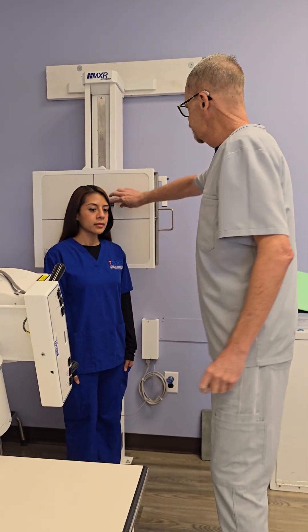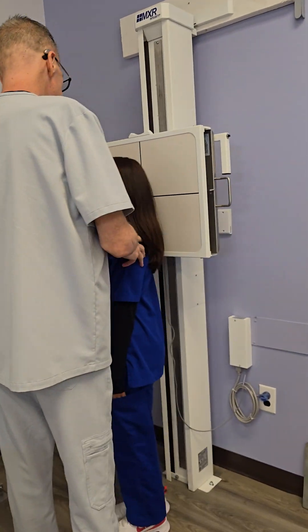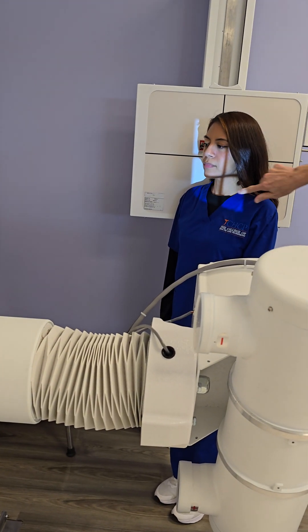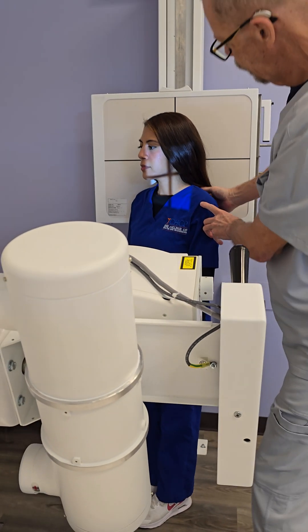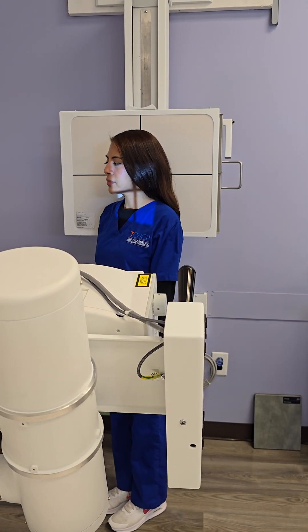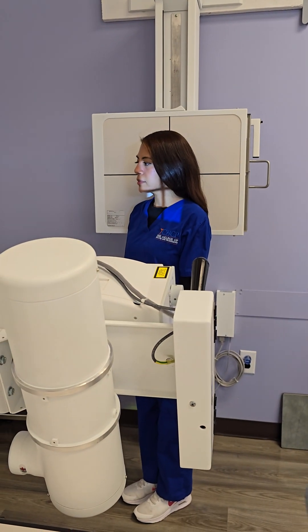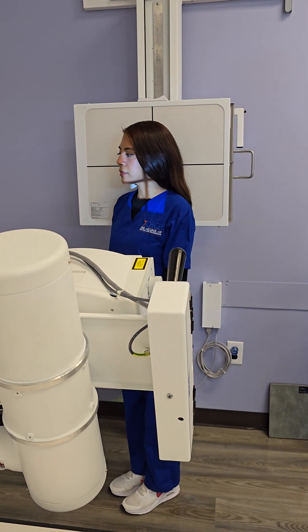We always do both obliques. So I'm going to rotate you the other way — go ahead and put your back to the board and turn this way. We're going to switch our marker because we are doing the right posterior oblique this time. Take a step forward towards the wall. We're still lined up with our CR and IR; didn't change our angle, just rotated the patient the opposite direction. She is now in an RPO — right posterior oblique — and for this one we are going to be seeing the left intervertebral foramen.